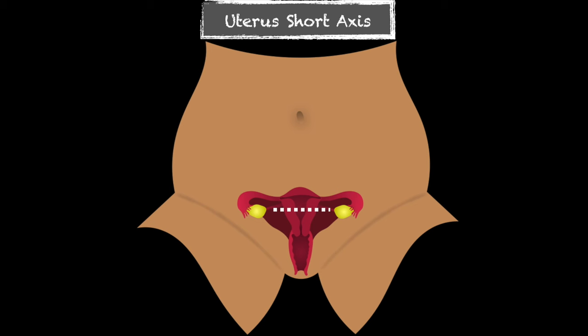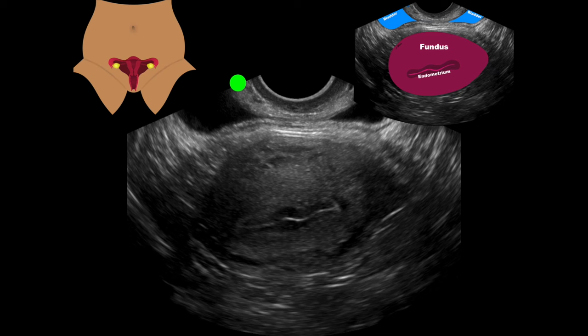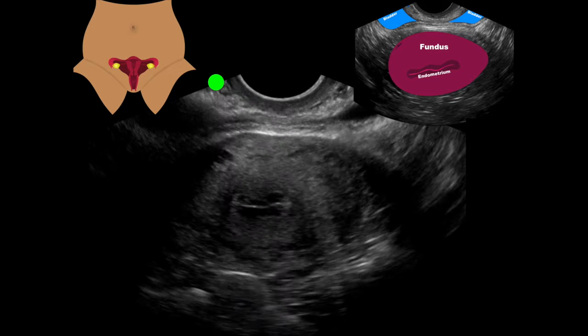Now we're going to do imaging in the short axis. We finished imaging in the long axis, then we find it in the short axis. I like to find the fundus in this view, identify that endometrial stripe, then fan through. We have that nice bright hyperechoic endometrial stripe surrounded by a hypoechoic to anechoic structure — that's your entire endometrium — and then we have our fundus around there. I fan up to the top of the fundus, then slowly fan down through to the cervix. Then I fan back up to the top, giving me a second time to check anatomy and identify normal versus abnormal. I save about five to six images all the way down through the cervix.